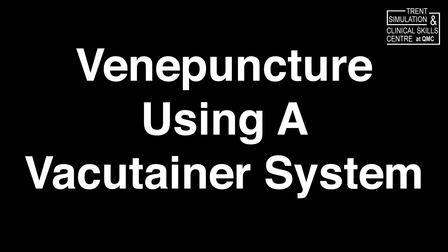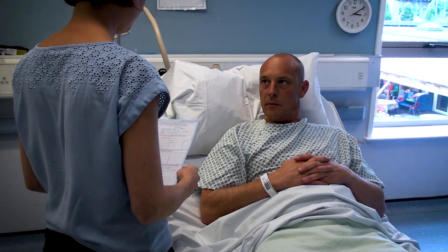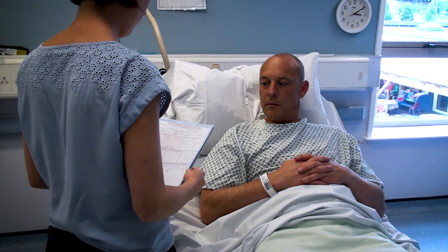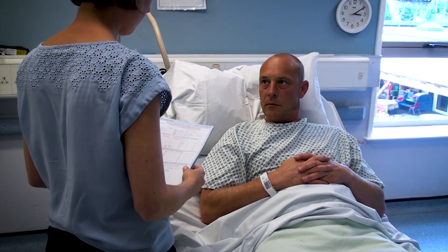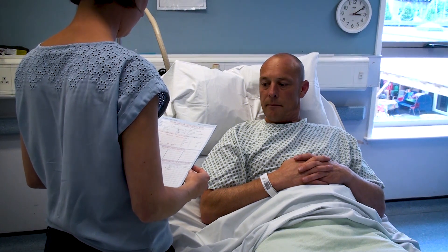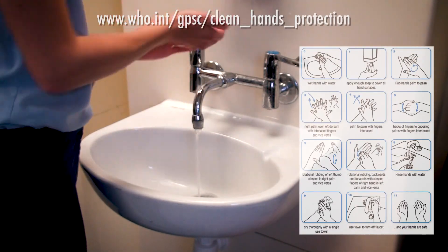Welcome to this clinical skills video for venepuncture using a vacutainer system. Prior to performing this procedure on a patient, you must ensure that you have explained the procedure you're about to perform and confirmed the patient's identity. You must then ensure that the patient is comfortably positioned with the elbow extended and supported, and wash your hands thoroughly using the 11-stage approach.